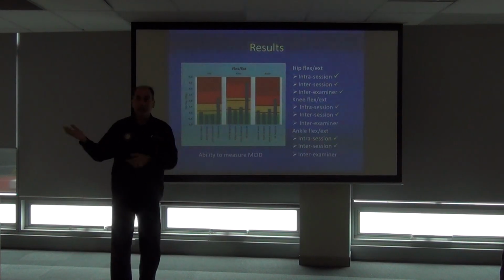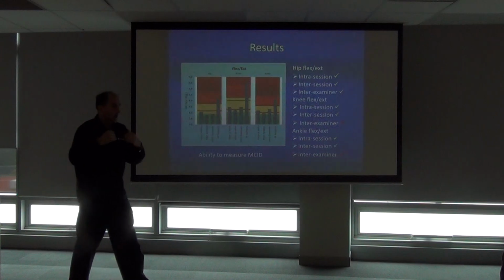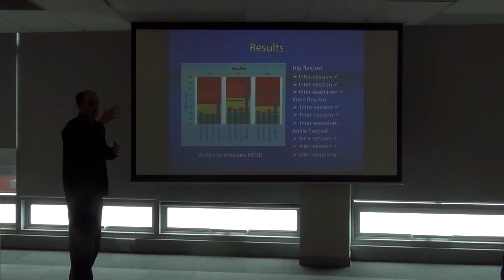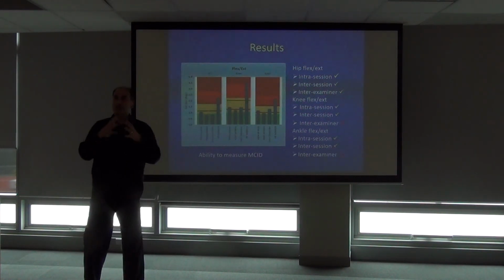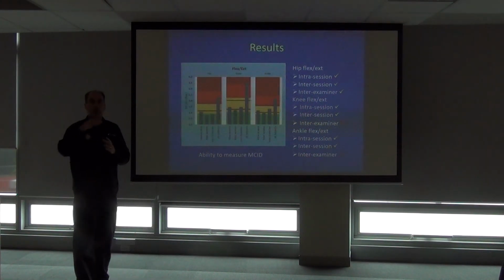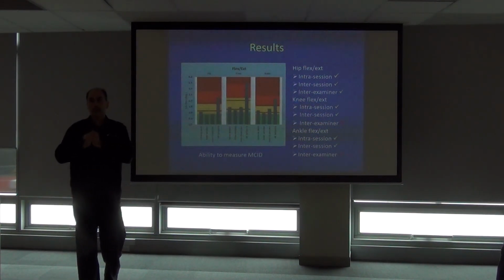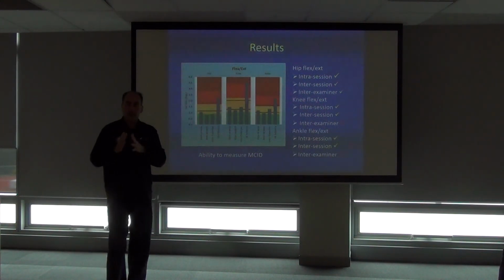Now there are assumptions here, that this is a normal pattern of what you'd expect for a normal, healthy, walking individual. And you're trying to minimise differences to that pattern to reduce that non-linear error, or as it's often termed, crosstalk. So you've got that as an overriding pattern that you're trying to match with your non-sagittal knee rotations.